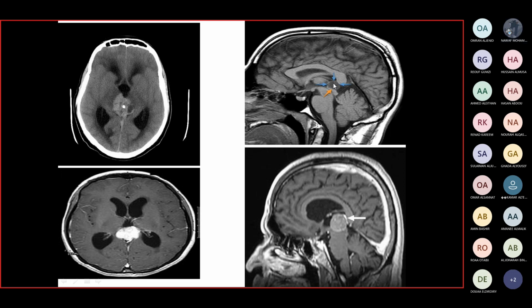But what is the intensity of this lesion? Oh, isointense in that case. Isointense to what? Gray matter. Yes, this is the gray matter, and this is the lesion. Is it similar in intensity to the gray matter? Yes, doctor. Look again. This is the intensity in this lesion. Is it similar to these areas? No, it's abnormal. Hyperintense.